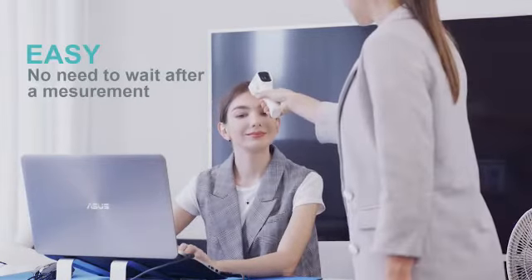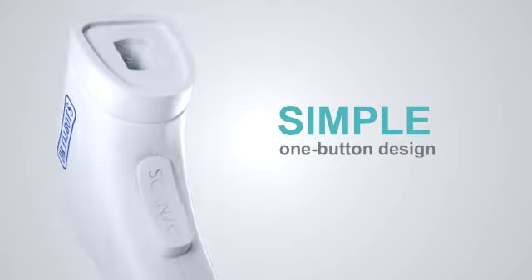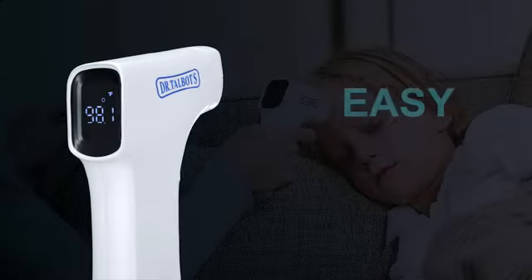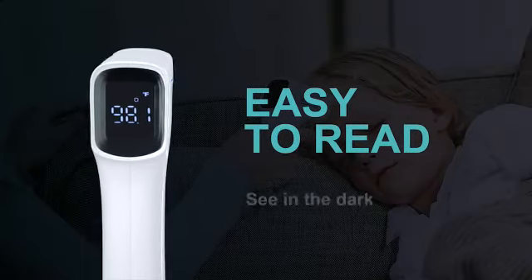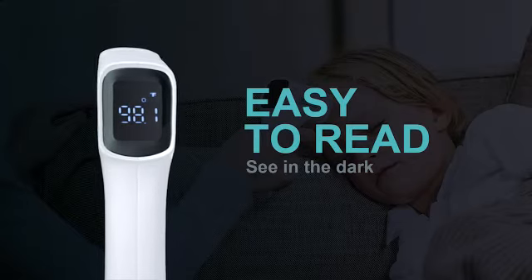You can check temperatures for different people easily and quickly. One button design makes taking temperature simple — just hit the button to turn on, then aim and press to begin. Our modern LED screen displays the reading in bright white light, so you can read clearly even in total darkness.